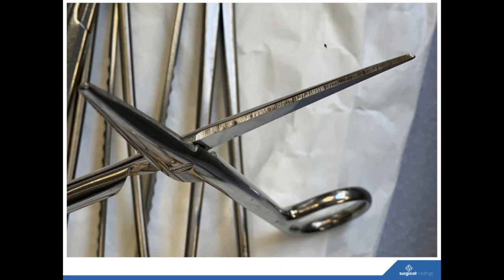I'm just going back to the surface finish side of things. That should be a nice clean polished finish to ensure that the device does what you need it to do, be that cutting tissue or whatever. But you don't want to be seeing that sort of finishing edge, because you're going to enhance the issues related to corrosion.